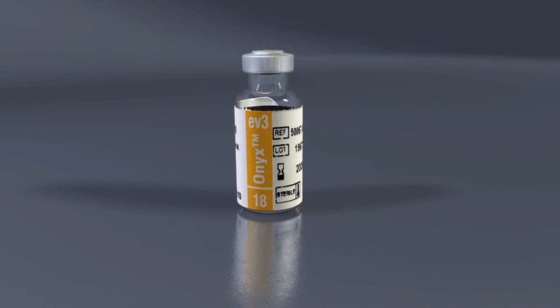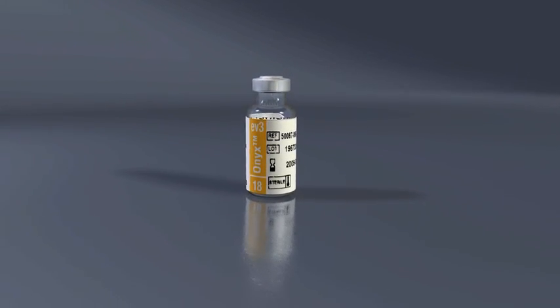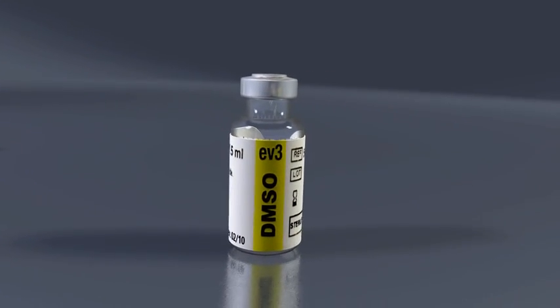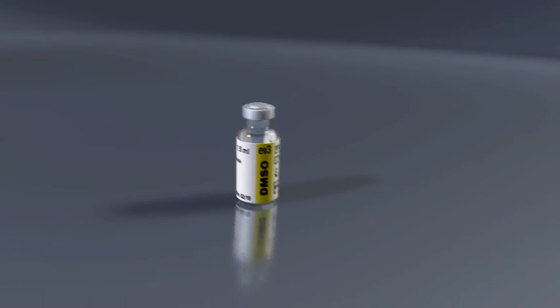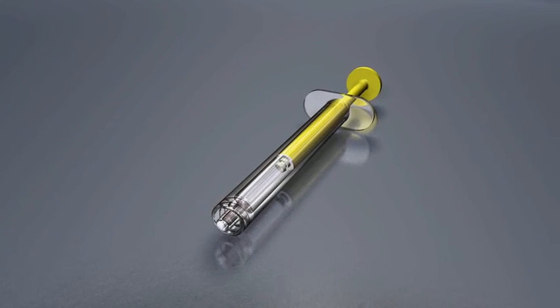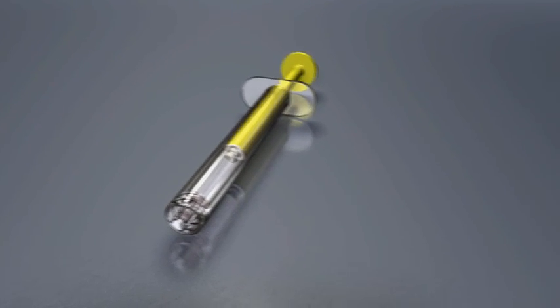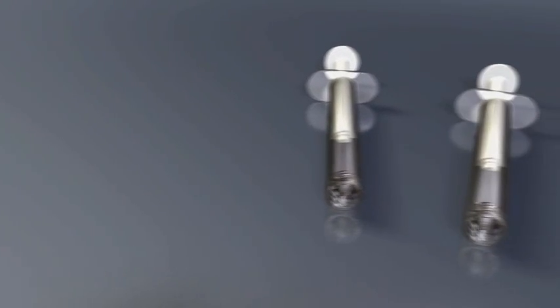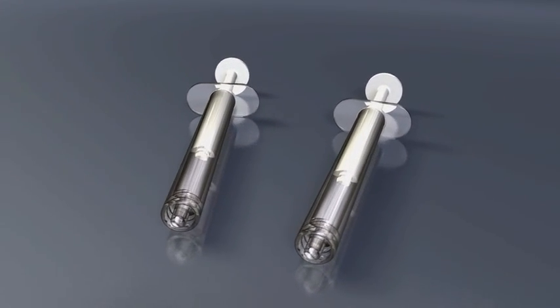The Onyx liquid embolic system consists of a 1.5 milliliter vial of Onyx, a 1.5 milliliter vial of DMSO, one yellow 1 milliliter DMSO syringe, and two white 1 milliliter Onyx delivery syringes.